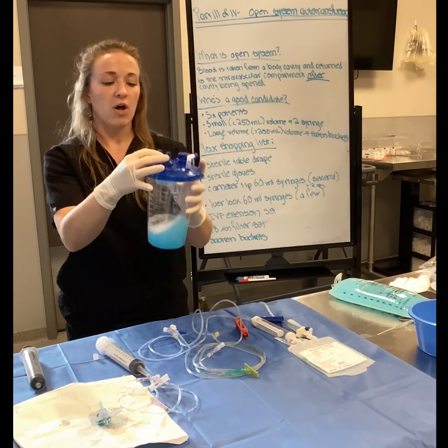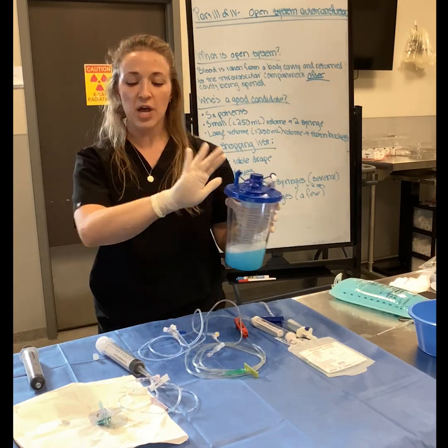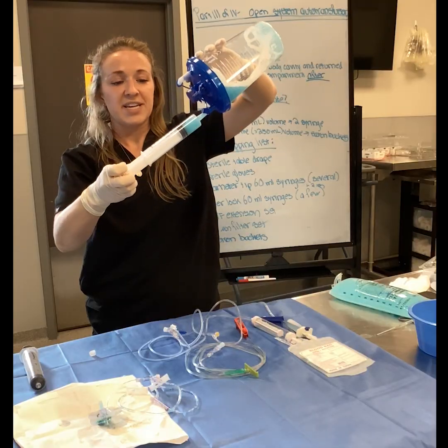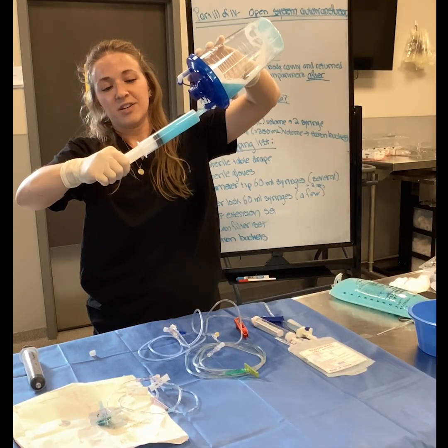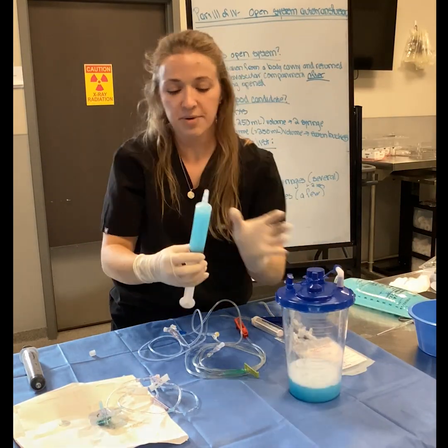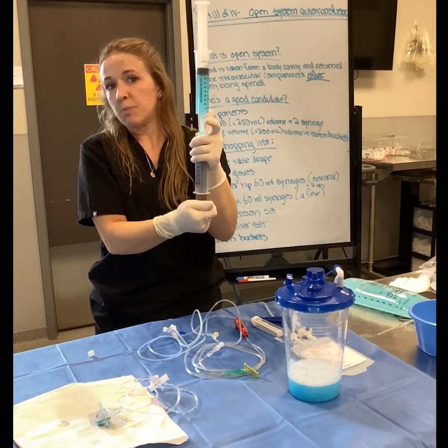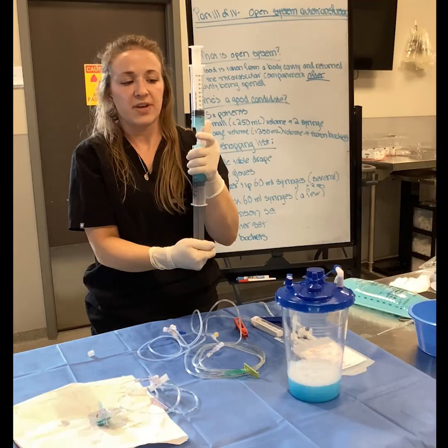That's just so I can attach things and just keep going here. Okay, so all I'm gonna do here is, with my sterile gloves on top of my drape here, this usually fits in quite nicely here. I'm gonna just take blood from one place to another, turn it upside down, and again, I don't even need to put any pressure on it. I just can take it out like this.